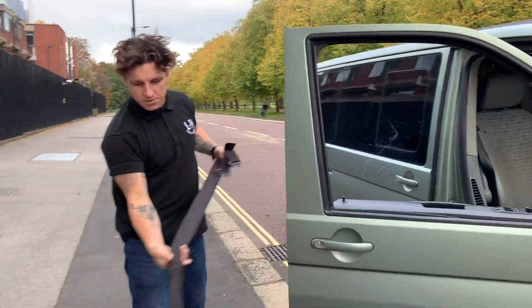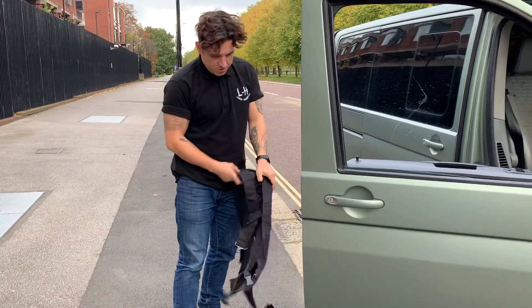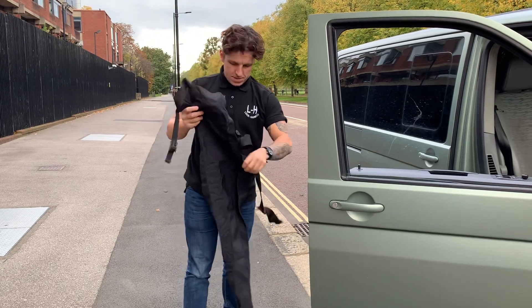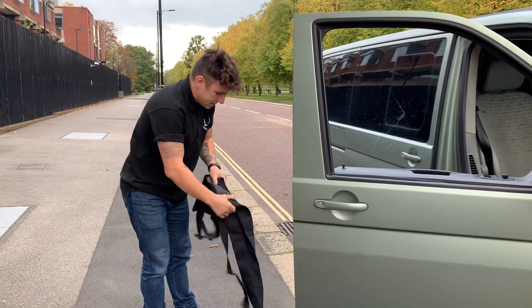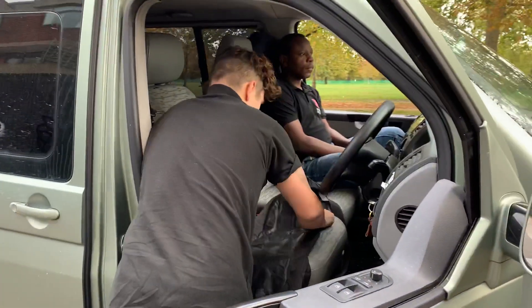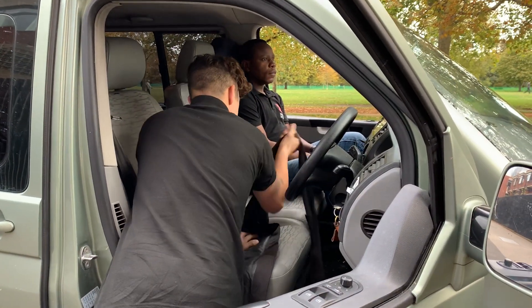First of all, we're just going to get the stretcher out, position it down in the vehicle so we can then get all the parts out nicely. Just going to lay that in the vehicle.